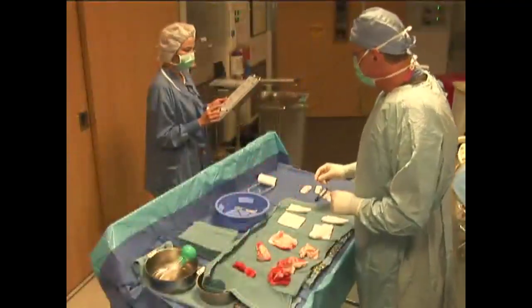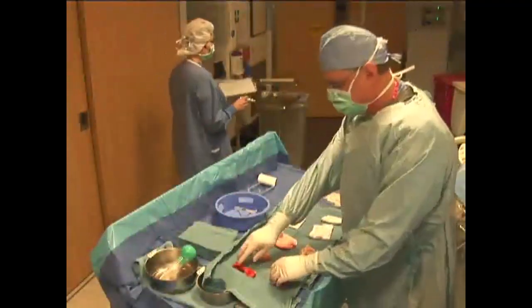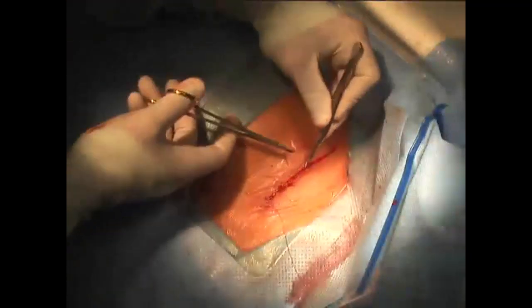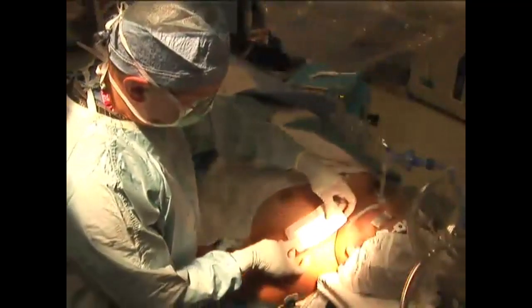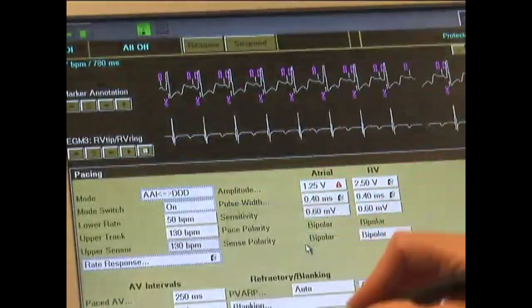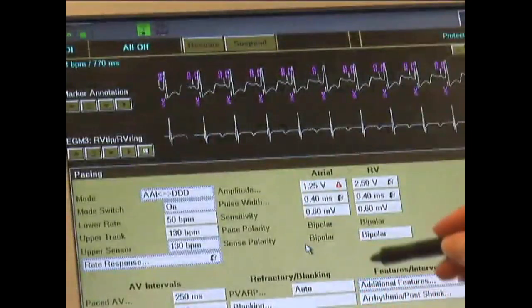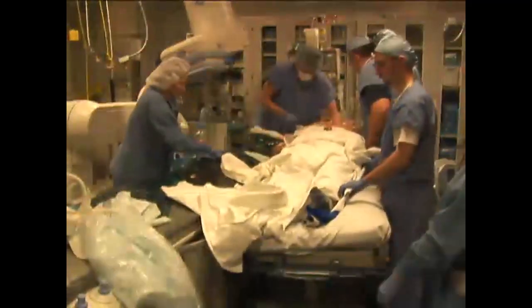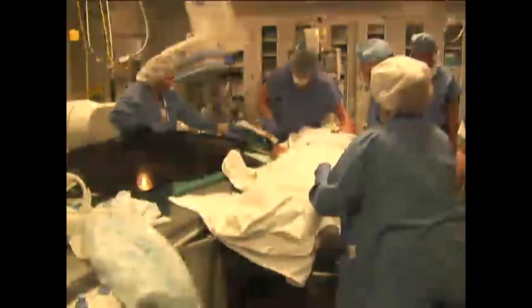Needle and sponge counts are completed. The superficial layer is closed with a layer of absorbable suture. After the area is cleaned, skin glue is applied. The drapes are removed and a dressing is placed. Final device settings are programmed for tachycardia and bradycardia therapies. The patient is transferred off the table and to the recovery area. The procedure is then complete.